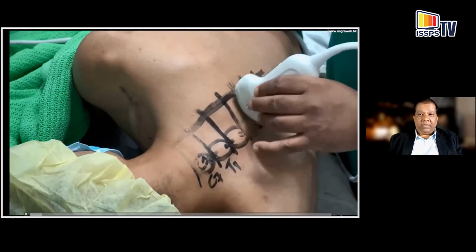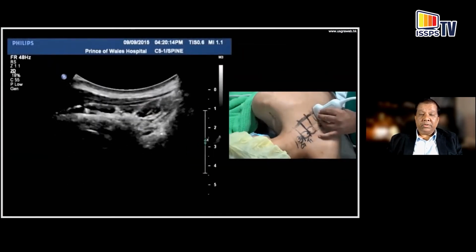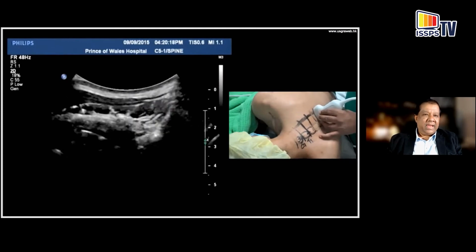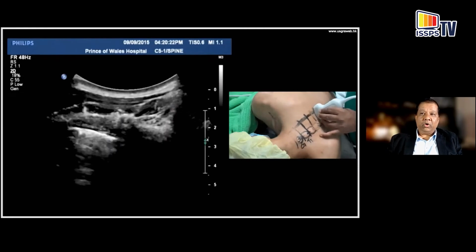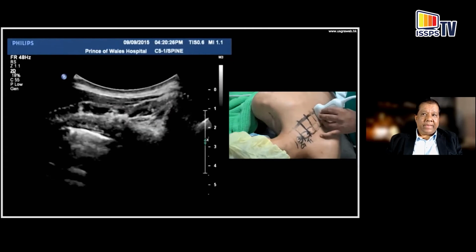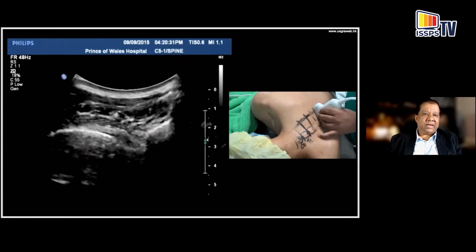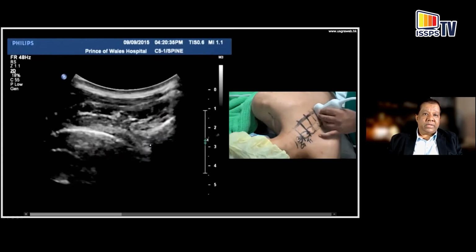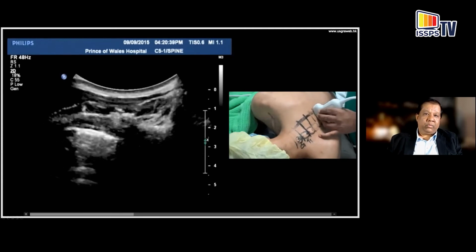So demonstrated in the video, at the mid-thoracic level, you can see the rib window. You can see the shadow of the spinous process, lamina, transverse process, and the rib. Yes, a bit of the pleura is visible occasionally with the tilt. Now we go below the rib, you can see the transverse process window. And this is often a case of slight tilt rather than a slide. So once you tilt it slightly further, now the transverse process shadow disappears, and now you can see the paravertebral space in this acoustic window here.